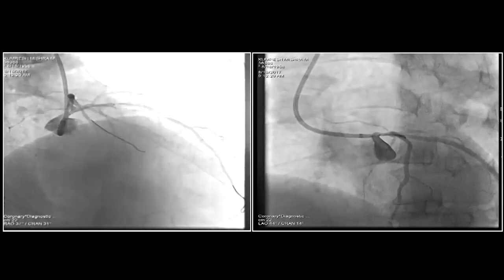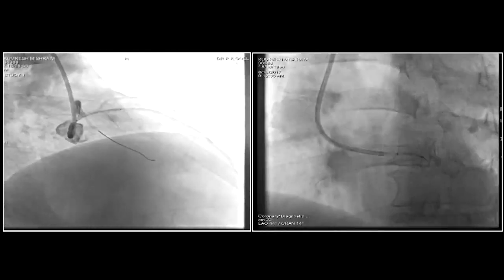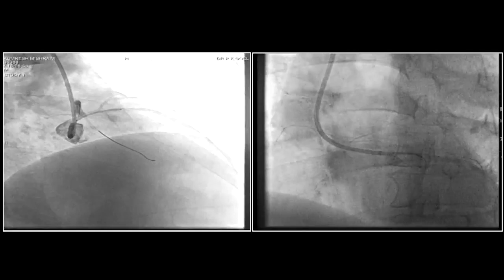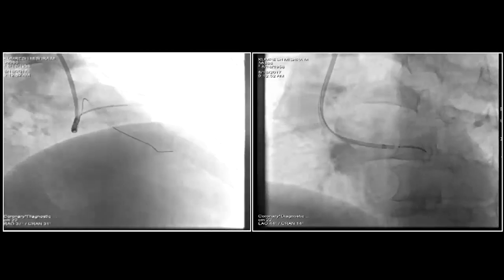Inject. A little more. I need to pull it back a little more. I mean, I think in this case, you essentially want the stent in the aorta, so you make sure you cover all the way to the ostium. Yes. Yeah, that's right. I am almost nearing the ostium because my disease is calling for it. Not because anything is short or long, because my disease is calling for it.